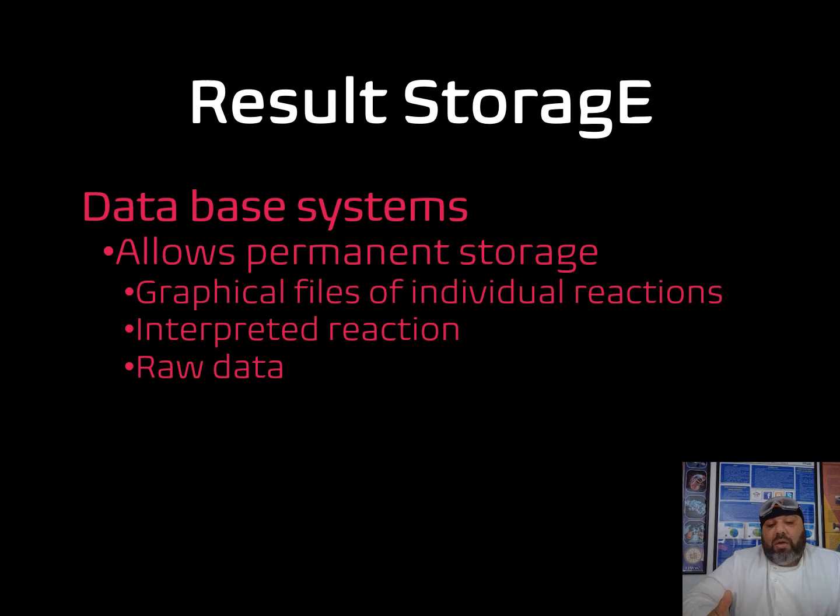And then there's also access to interpreted reactions, again in line with specific tests and investigations. And then there was also raw data. Generally, where pathology automation is concerned, most professionals have access to the raw data that is aligned to pathology automation.